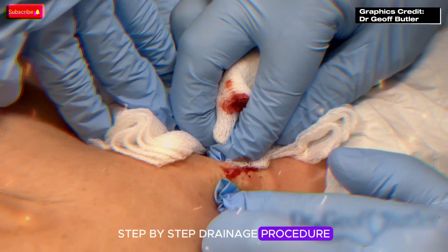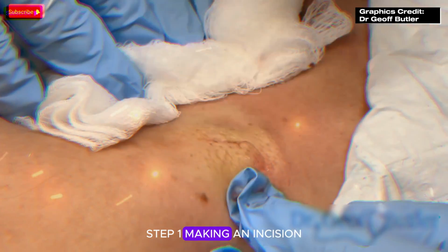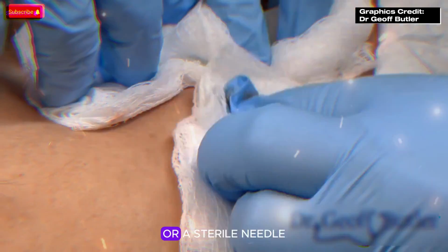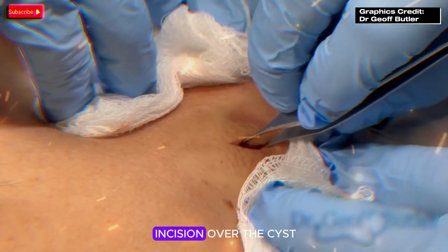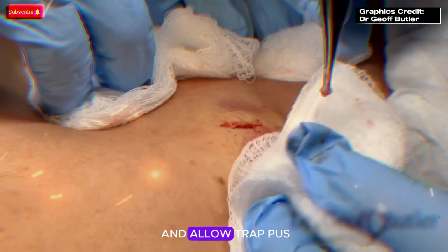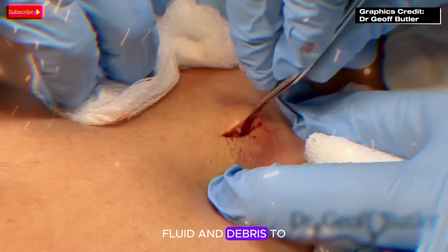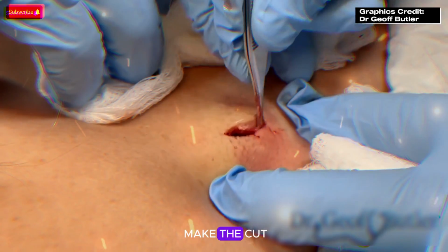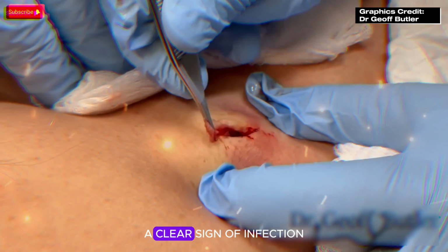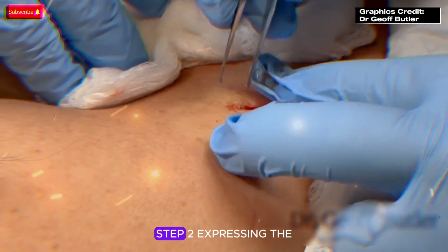Step-by-step drainage procedure. Step 1. Making an incision. Once the area is numb, we use a scalpel or a sterile needle to make a small incision over the cyst. The goal is to open up the cyst and allow trapped pus, fluid, and debris to drain out. As soon as we make the cut, thick yellowish or white pus will start to come out, a clear sign of infection.